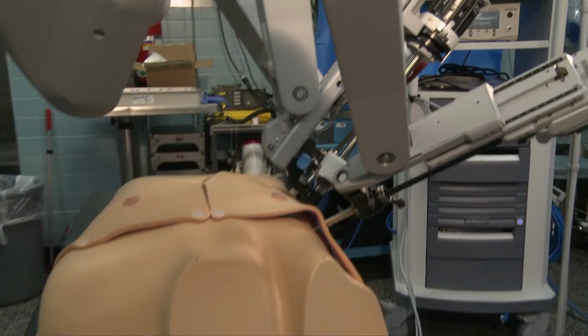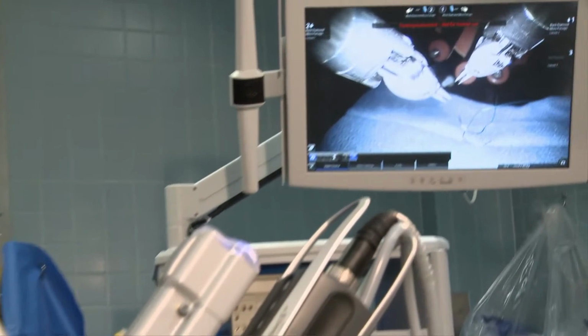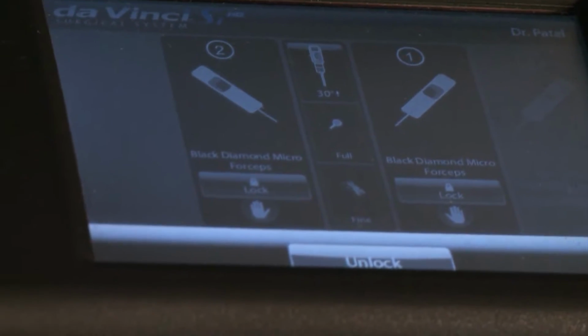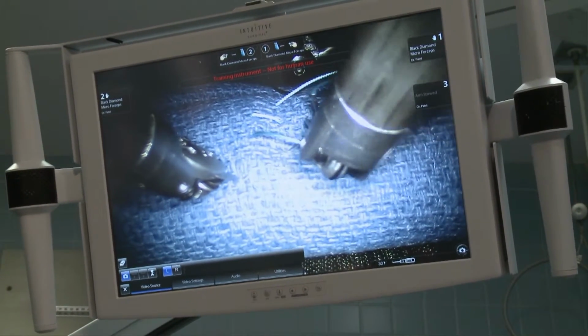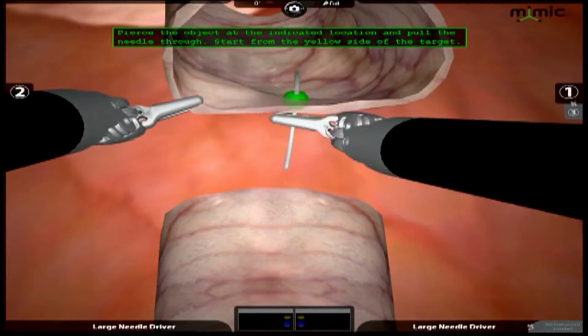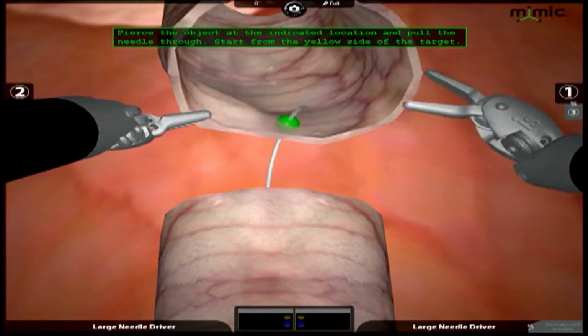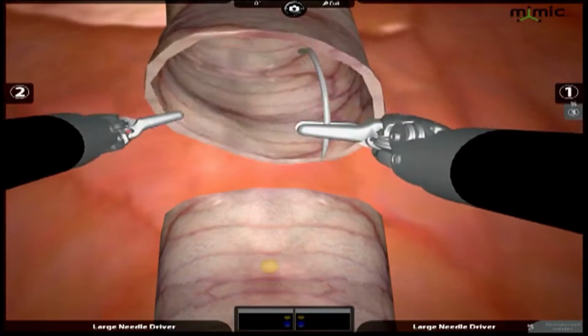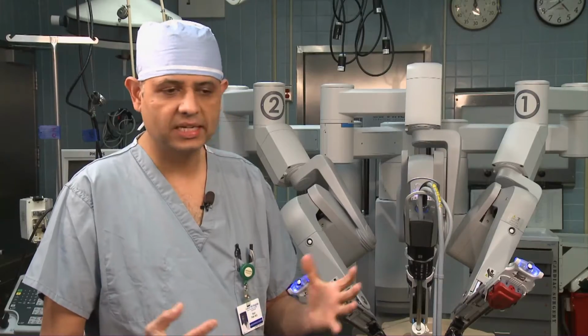Using a demonstration mannequin, we could see how robotic scalpel instruments are inserted into a patient. Using a high-definition camera and extreme magnification, surgeons can look closely at the area where the procedure is taking place. It is in high def, and it is three-dimensional. What if something went a little differently than you expected it? Can you move away from the Da Vinci surgery in the middle of an operation? Yes, exactly. It is very simple.